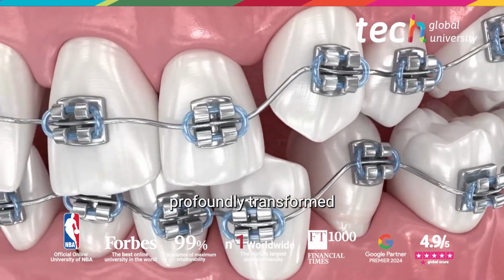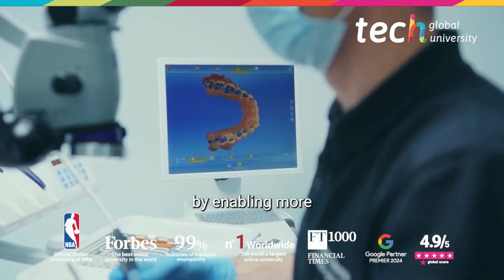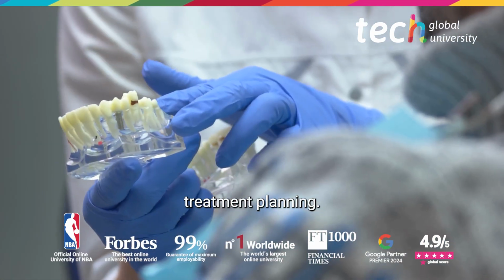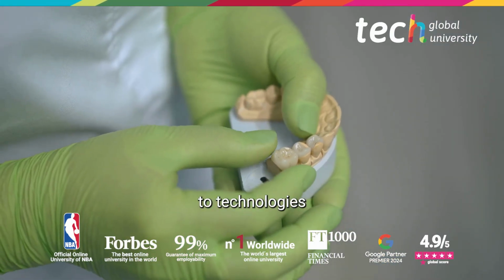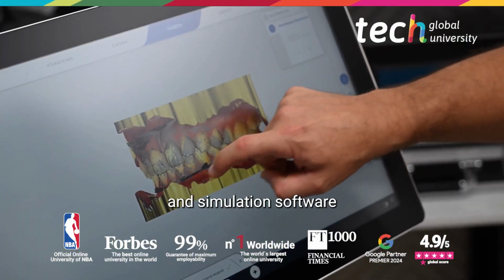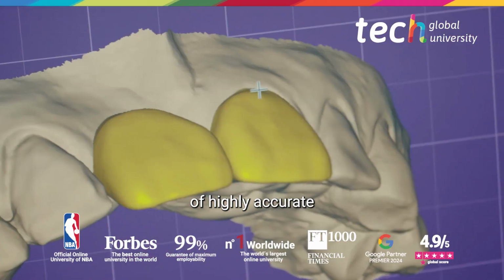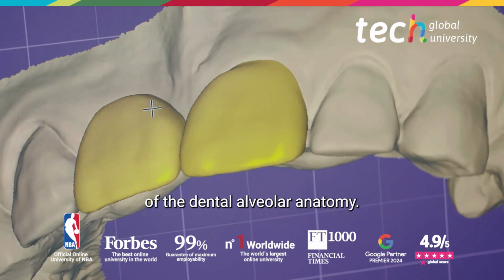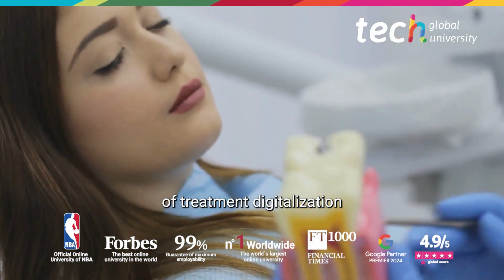Digital models have profoundly transformed contemporary orthodontics by enabling more precise, predictable, and patient-specific treatment planning. The shift from plaster models and alginate impressions to technologies such as intraoral scanners, 3D printing, and simulation software has facilitated the acquisition of highly accurate three-dimensional representations of the dentoalveolar anatomy, optimizing every stage of treatment.